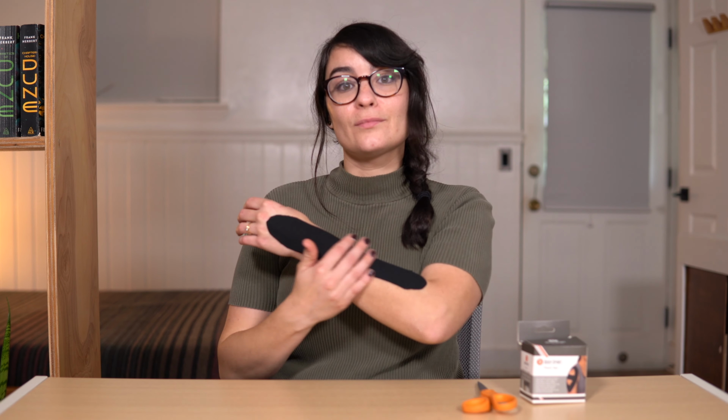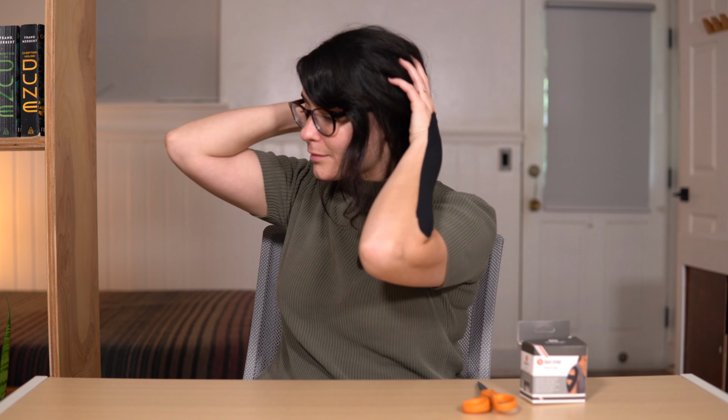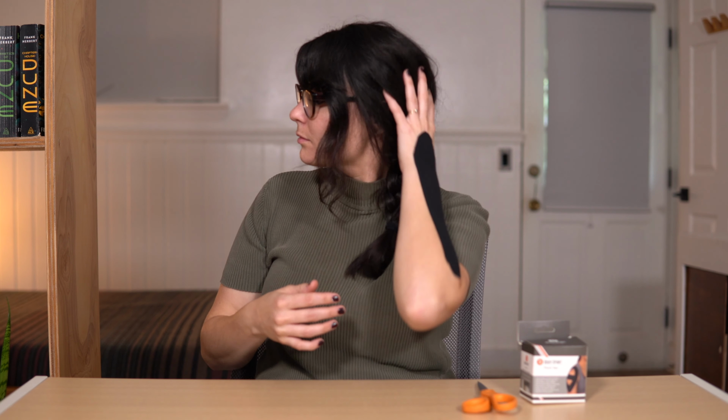So you've got the Kinesio tape on. What do we do now? You are going to get the best results with Kinesio tape by trying to engage in functional activities. And I'm showing you here trying to mimic washing your hair. You can actually wear Kinesio tape in the shower. It just may come off more quickly if it gets wet. But washing your hair requires some degree of wrist extension.